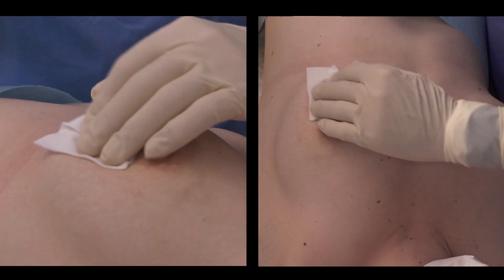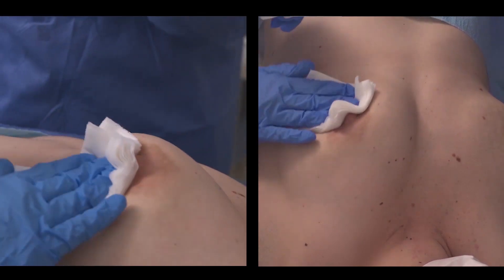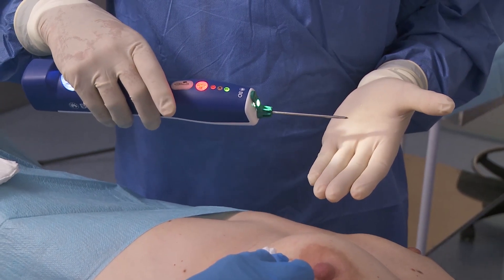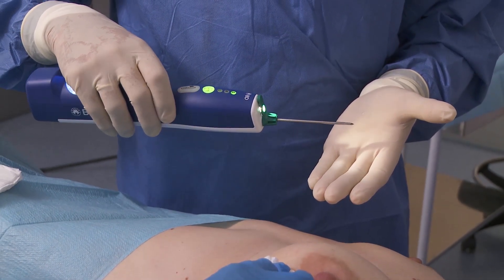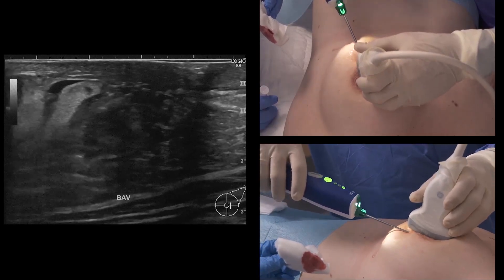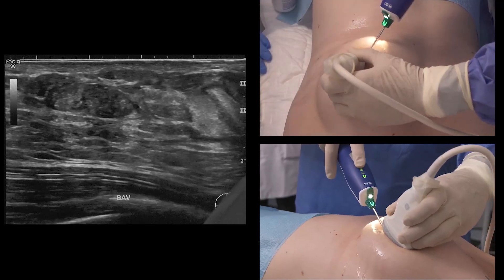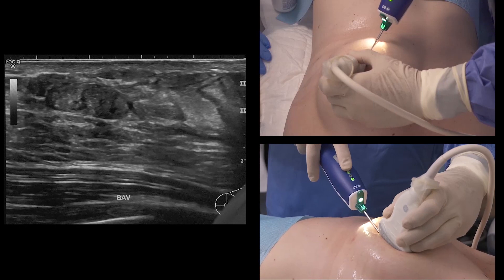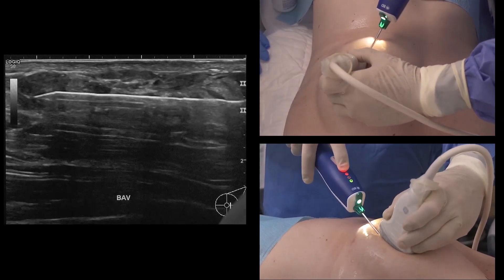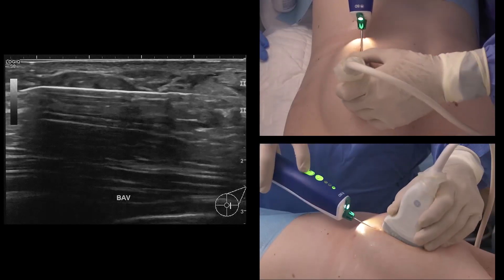The probe has already been attached to the driver. The prime pierce feature is used in this case since the area of interest would be difficult to pierce manually. Proceed with needle insertion to the pre-fire position. The driver headlight helps to provide a clearer view of the biopsy area. Fire the device when the needle tip is approaching the lesion. For correct needle tip placement, consider that the stroke is 20 mm.